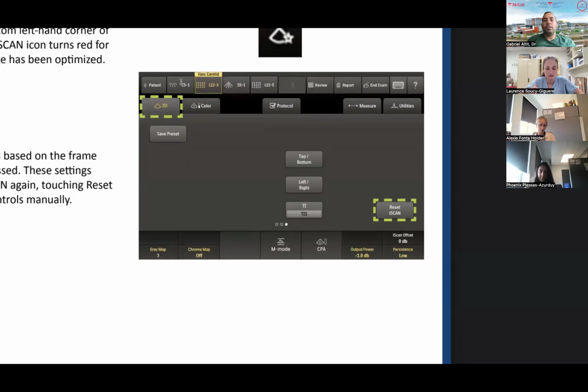On your touchscreen, you can select your probe on top, which is basically following the order of where you plugged your different probes. And then within your probe, you're going to be selecting the different presets that you would want. These presets have been calibrated typically on whichever preferred imaging you locally have selected. So our presets were organized with a technologist from Philips who came in, we scanned, and we decided that these were the images.